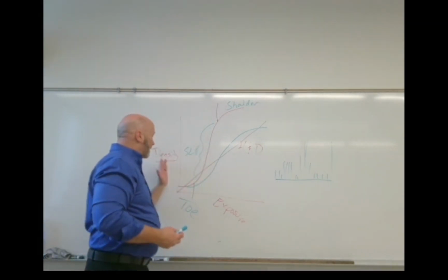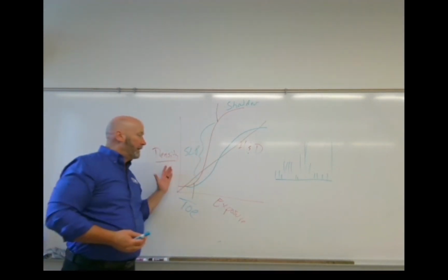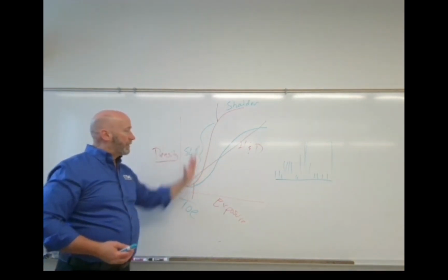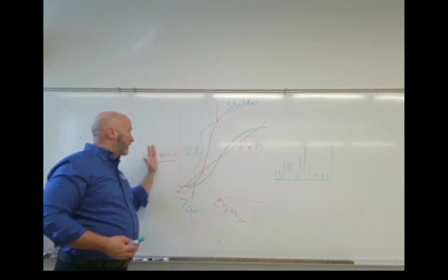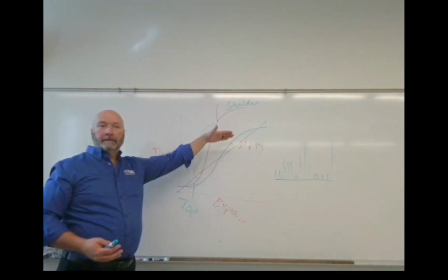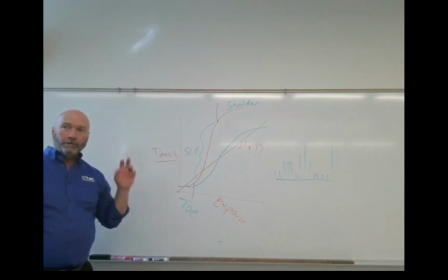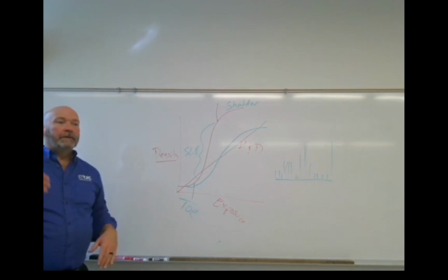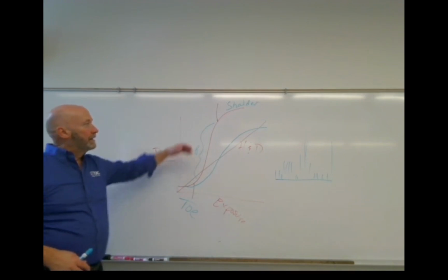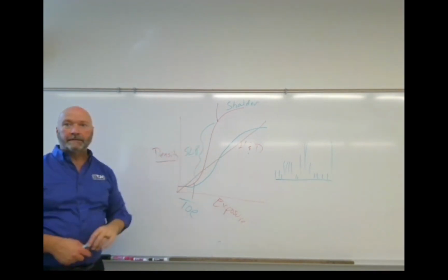The straight line portion closer to the density axis, in general, not always, but in general, indicates a higher speed. Okay? So vertical, contrast, close to the density axis, high speed. Horizontal, low contrast, further away from the density axis, low speed. Straight line portion, useful densities. Toe portion, your exposure's so low that you lost contrast. Shoulder portion, exposure so high, you also lost contrast. Straight line, useful densities.